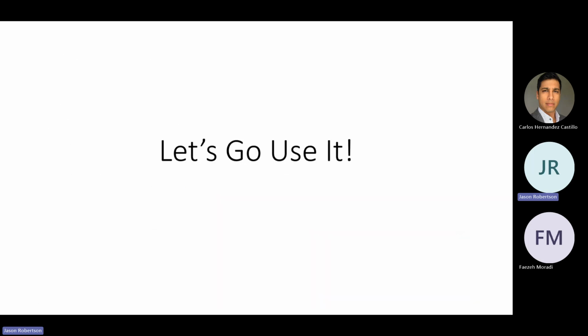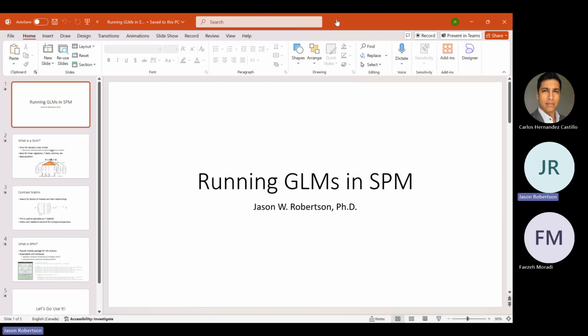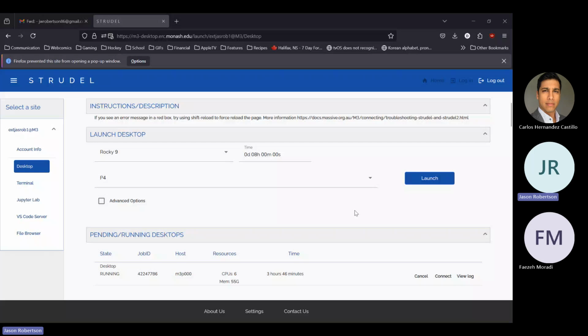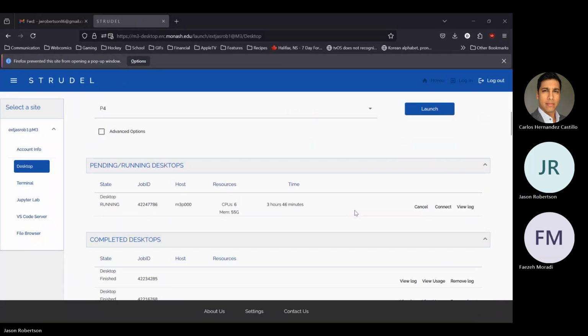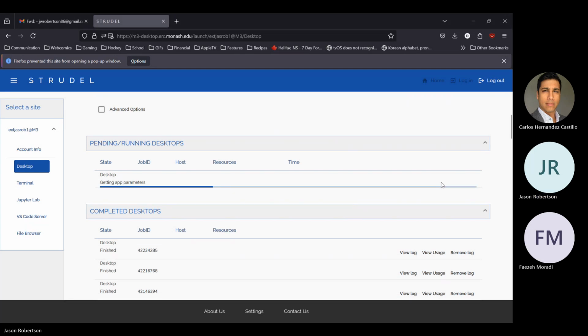So that is as much as I had on a PowerPoint, because the rest of this is going to be all practical. So I'm going to stop sharing PowerPoint and start sharing this instead. I'm going to connect to the desktop I've got running here.